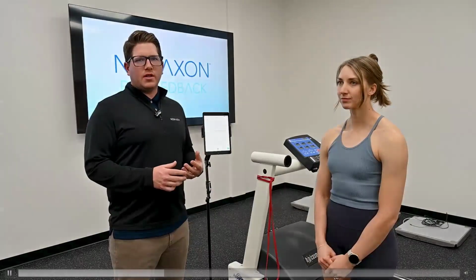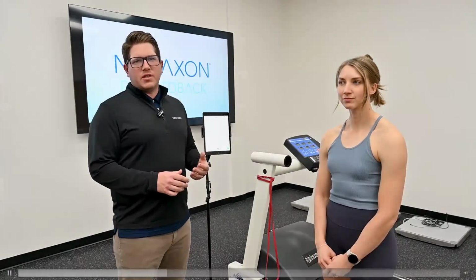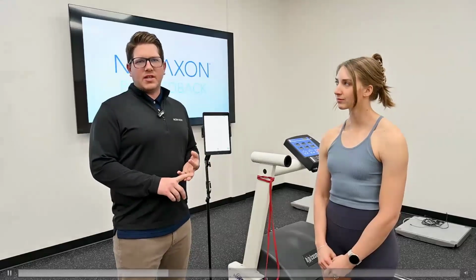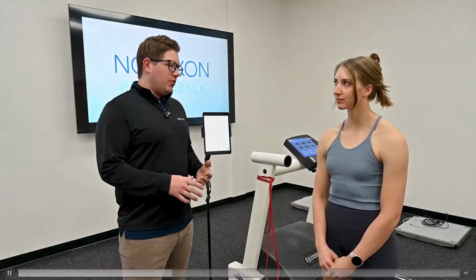Learning how to recruit certain muscles, look at the activation profiles between the different sides, as well as establish maybe some targeted threshold training. So we have options in here to be able to set those thresholds, to be able to normalize the EMG data to an MVC, and really allow for targeted use of the live EMG biofeedback data. Now we'll move into our exercise and show you how that all works.